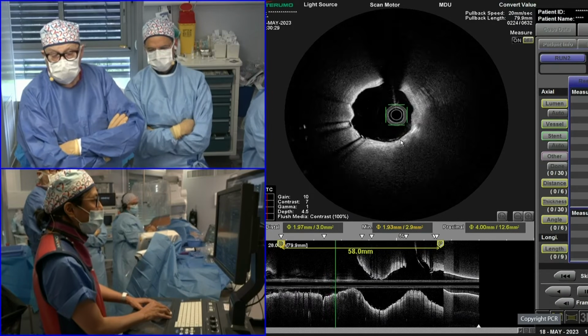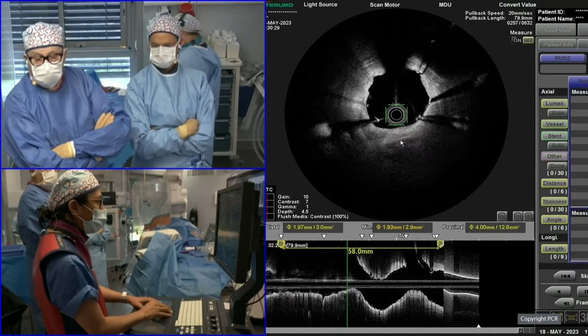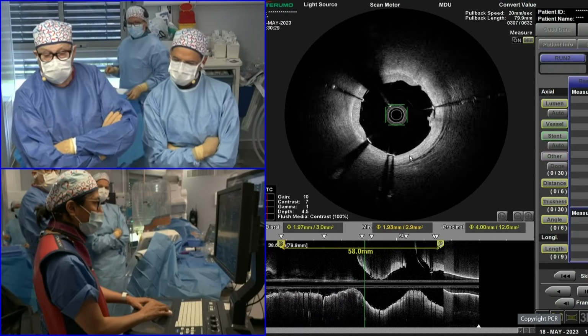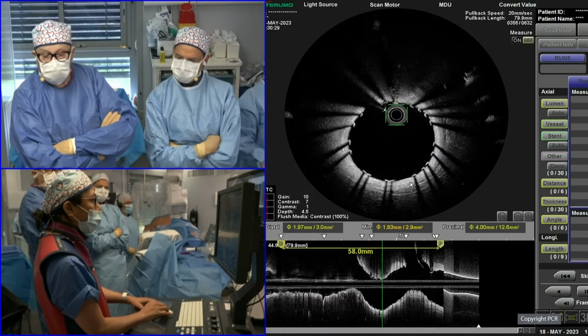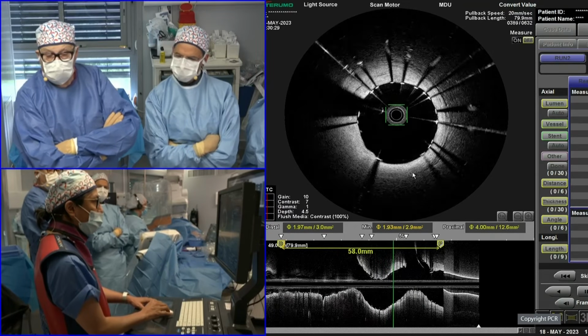We have some concern about expansion of the stent around the diagonal branch, because there was some calcification, but I must say that after the bifurcation, the expansion is relatively good. I just measured, it was 3 millimeters. There's an overlap segment of these two stents, and I think the mid part is also expanded well.